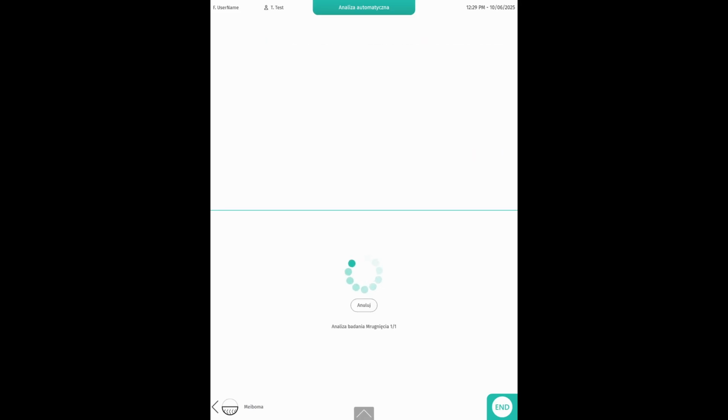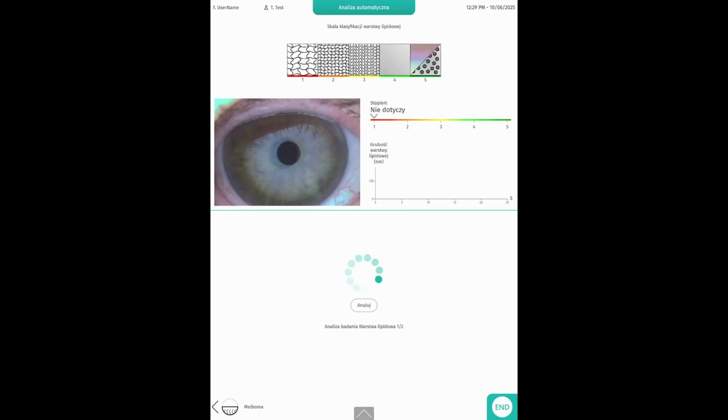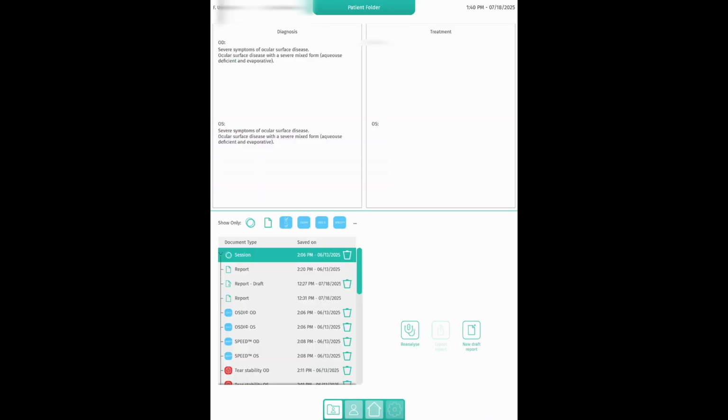This time is necessary for the AI algorithms to actually properly calculate this. If you're using ChatGPT, then sometimes you don't get the answer right away, right? You still need to wait, and this is happening here. Once you are done with the imaging, you can see it. You don't need any special software right on the machine.